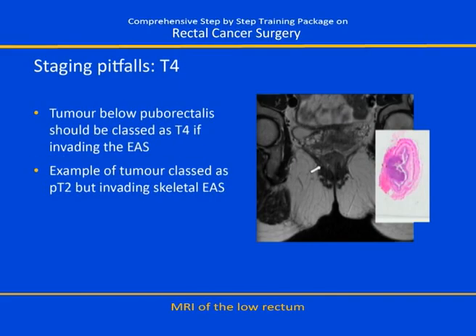The other thing is understanding that this conventional TNM staging in rectal cancer doesn't lend itself terribly well for assessment of low rectal cancer. You can see a T4 tumour that's invading the external sphincter that may actually be much more readily operable because you have more space at the level of the sphincter than, for example, a T3 tumour anteriorly abutting the prostate or the urethra. And so the stage itself is rather unhelpful.